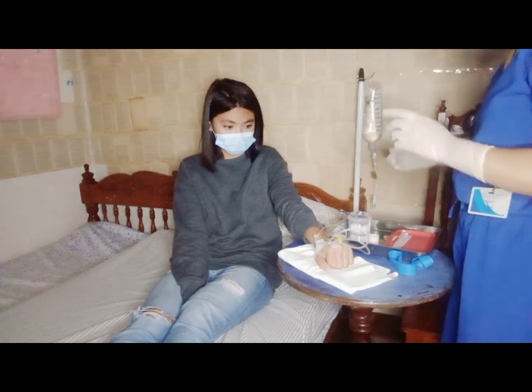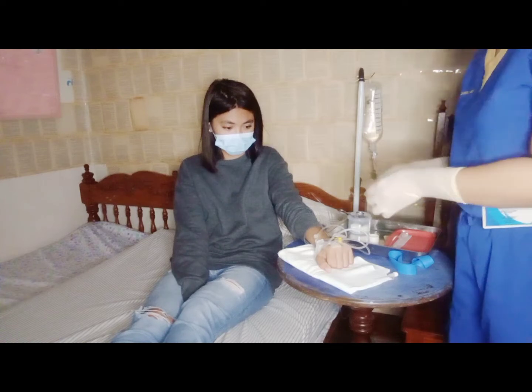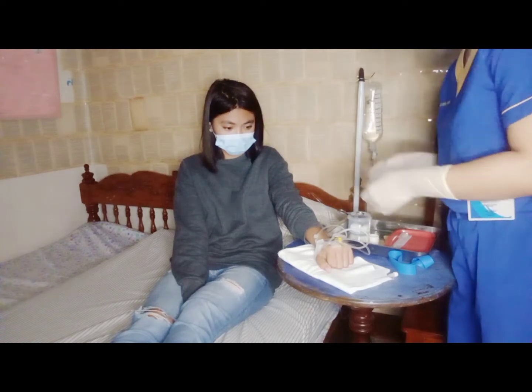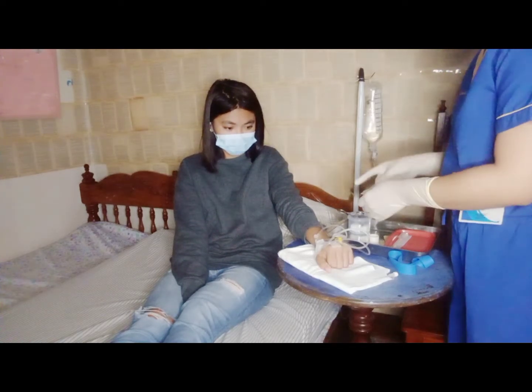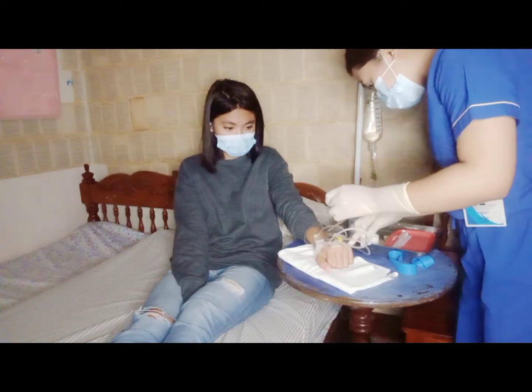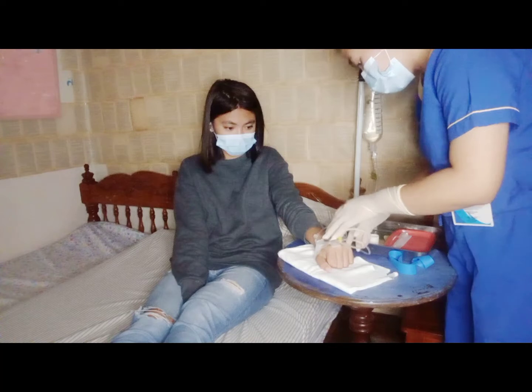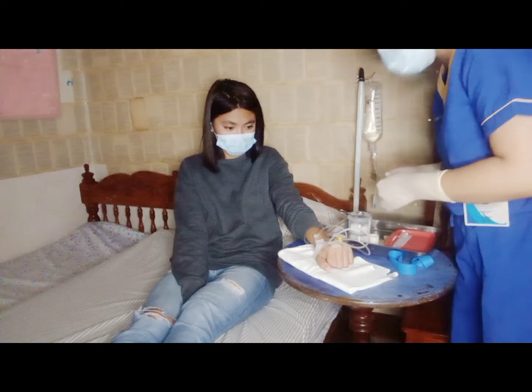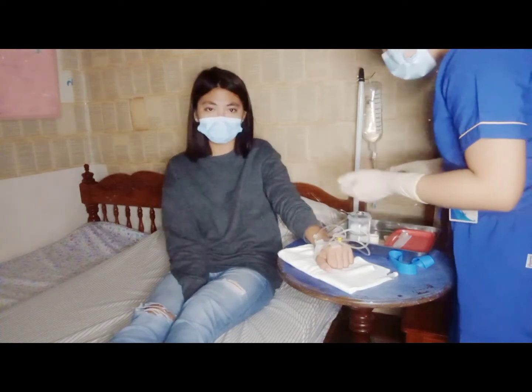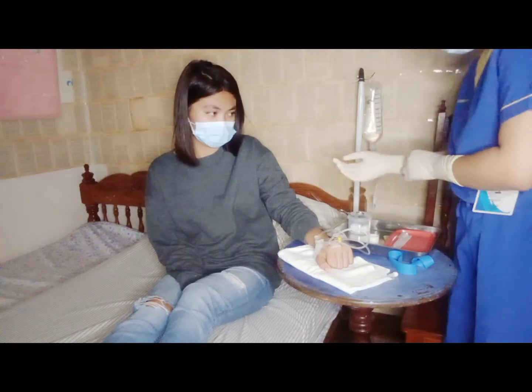Then after attaching the administration set to the extension tubing, we will put on the label of the dressing, which indicates the date of the insertion, the time, the site which is the dorsal metacarpal vein, and the size of the catheter, which is 24 gauge. Okay?